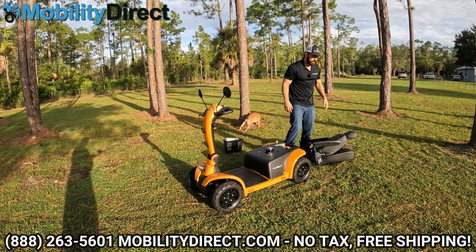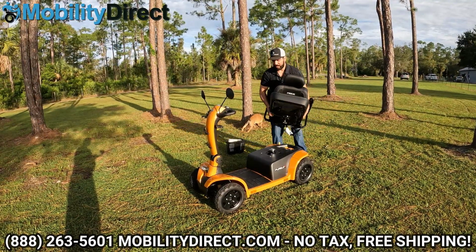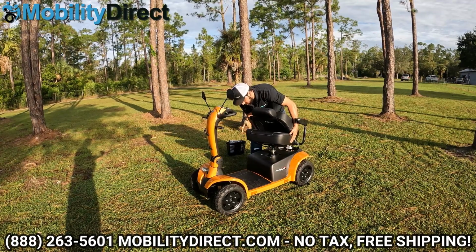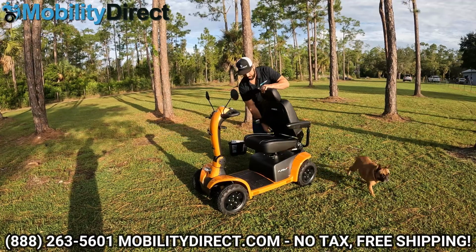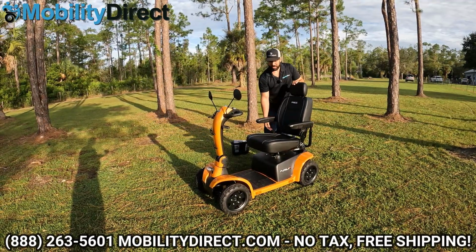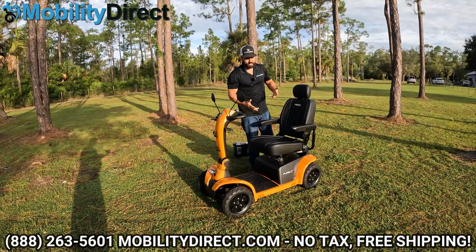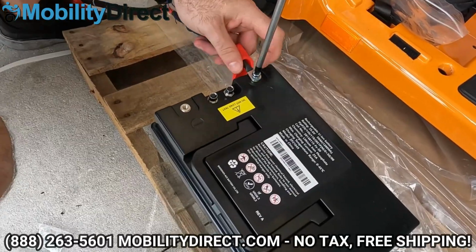Putting the seat back on, the seat's a little heavy, I'm not going to lie. I've done it many times, so I can, without looking, know where that seat post is, and the male connector just drops right in. It does take practice though. And the seat is kind of heavy, so you may need assistance taking the seat off and putting it back on.